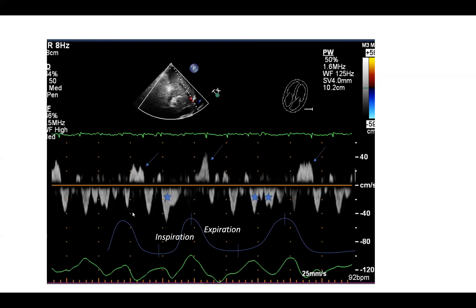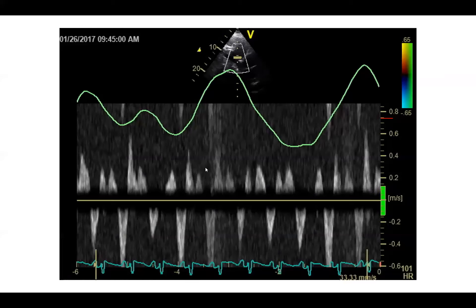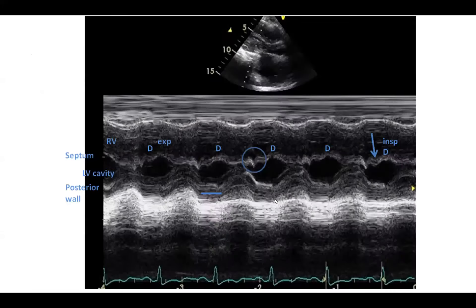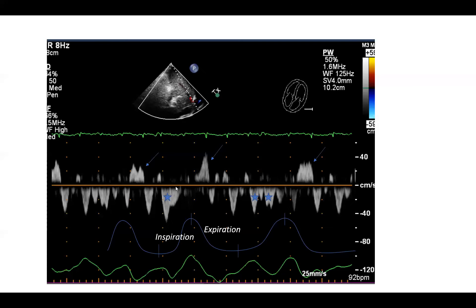This is how we record it: slow sweep speed, and it's nice to have a respirometer. Compare forward waves with backward. Forward flow in hepatic vein looks down. Mayo has quantified this using a ratio of 0.79 — if that backward expiratory flow is almost equal to the forward flow, that's very suggestive of constrictive pericarditis. In expiration, look how it reverses; whereas in inspiration, D is forward. It's hard to distinguish D from S, but compare backward versus forward.